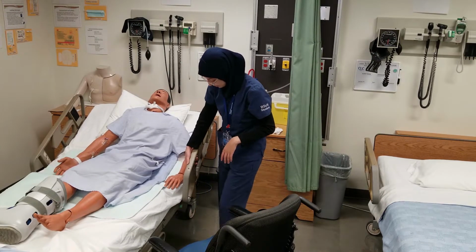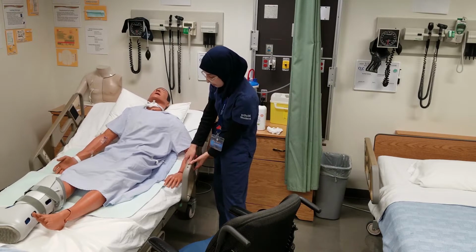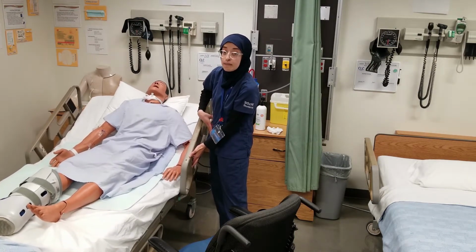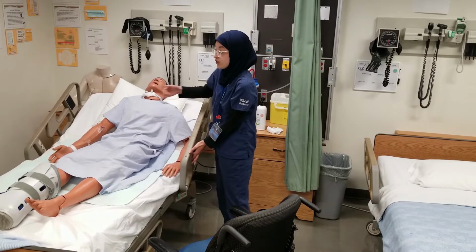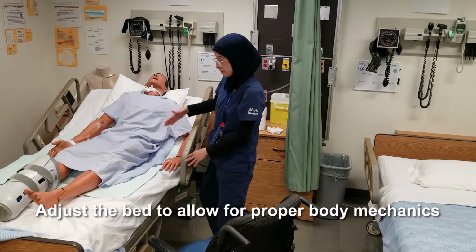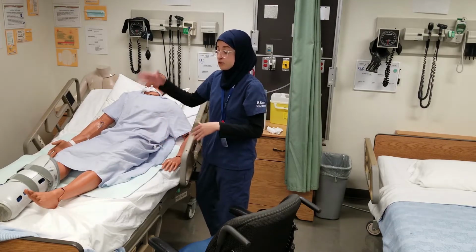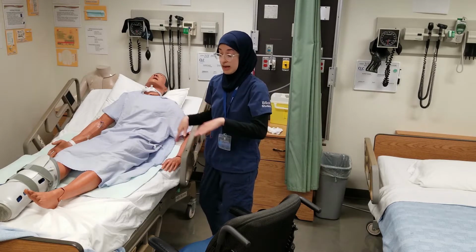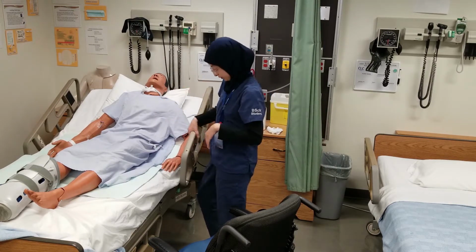Alrighty. And I'm just going to move the height of the bed to my waist so that it's at a good angle for me and I'm not straining my back as I turn the patient. So that's a good level. I don't want to place it too high where it's at a risk for the patient. I'm also going to make sure that I'm moving the level of the bed back down once I have completed what I have to do.